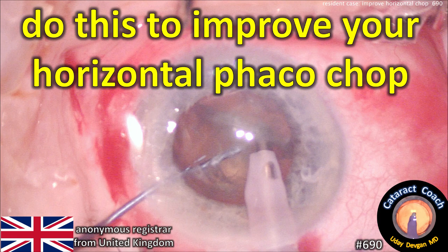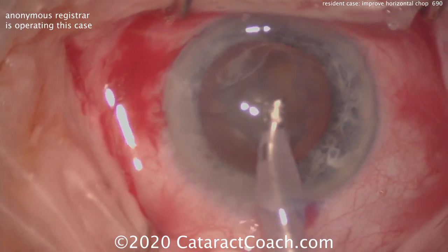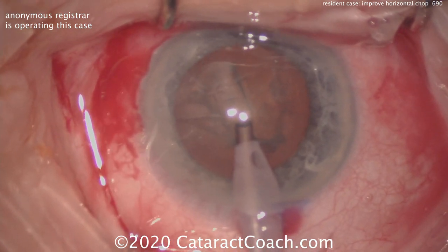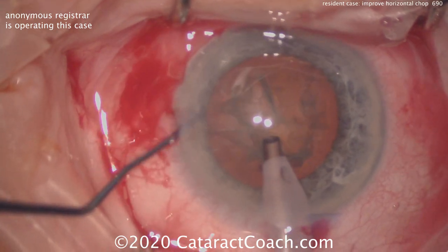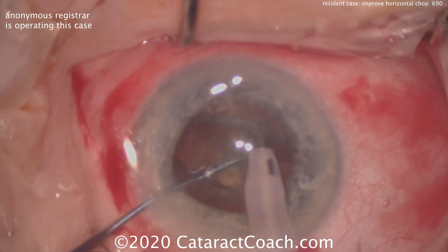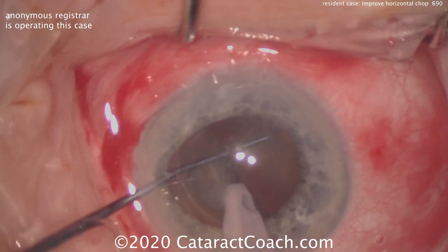cataractcoach.com — do this to improve your horizontal phaco chop technique. We have a video from an anonymous registrar who's doing training in the United Kingdom. Sitting superiorly, the rhexis has been done, here's the nucleus, phaco probe's in the eye, and let's watch what happens — coming in with the chopper, going for the chop technique, chopper's being embedded into the nucleus and the chop is attempted and it's reasonable. But what wasn't great about this?